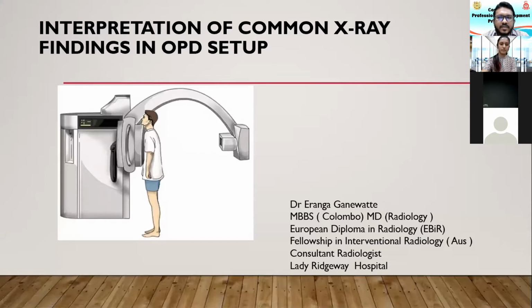So basically, I'll be going through some of the basic interpretation of chest X-rays, and I'll be just touching on some of the anatomy, the technical aspects that you need to know, and a few of the common presentations in the OPD settings that you will be able to recognize and easily diagnose without the help of a radiologist.